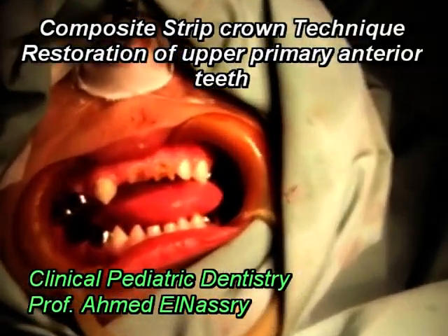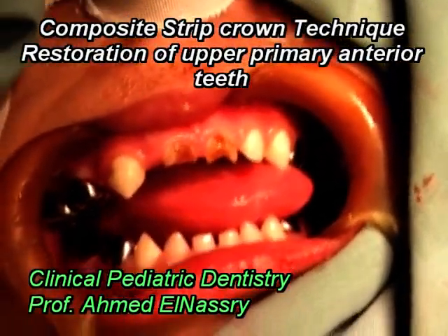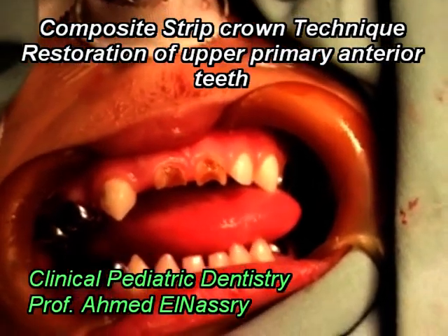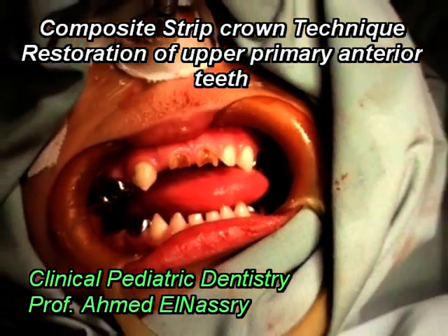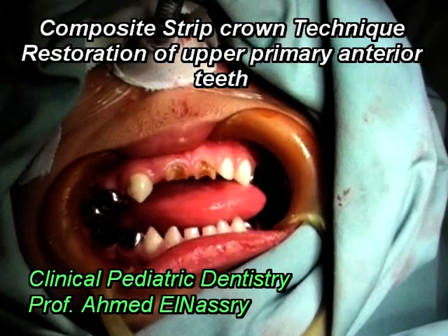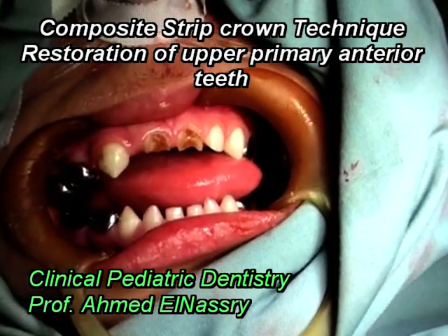Baby with badly destructed upper primary anterior teeth and congenitally missing 5-2. We decide in this case to restore the teeth with celluloid crown technique.